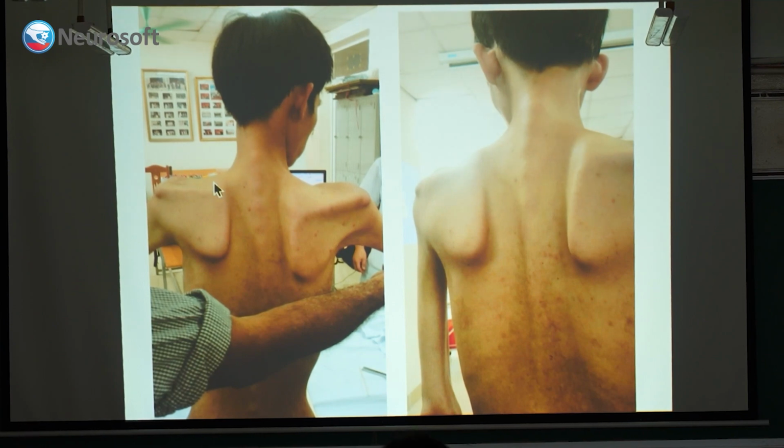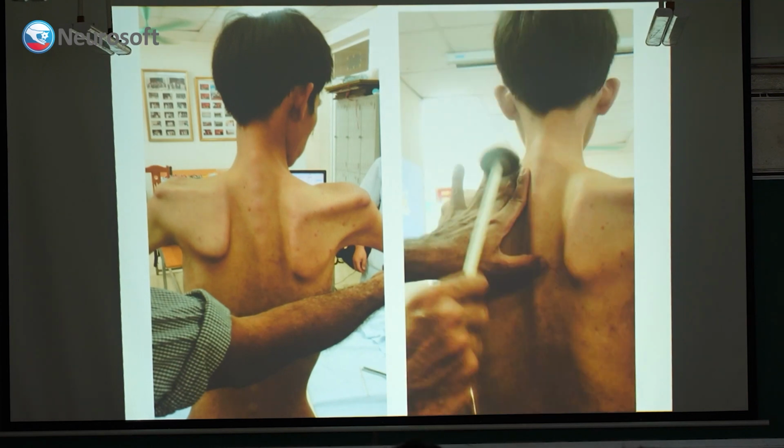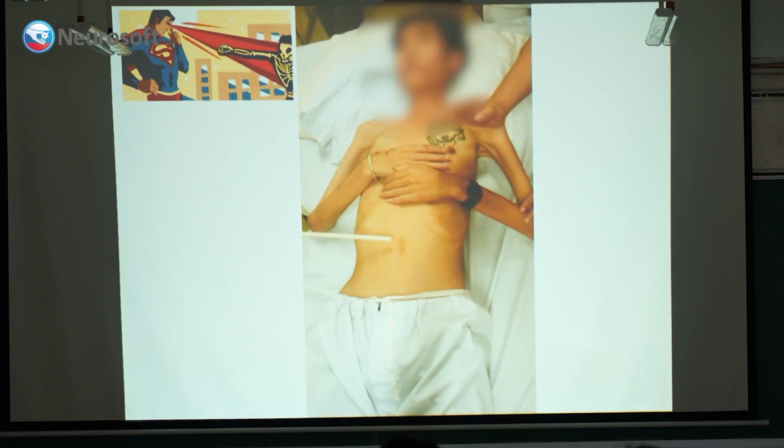And also you can see paraspinal muscles are atrophic. You can see the spine well, prominent. It means that paraspinal muscles are also atrophic, right? I think in this case, I would actually suspect the possibility of late onset Pompe disease. Of course, it's rare, but because it's a treatable condition, I think you should prioritize that. We have to find the patient. Yes, and also when he was lying down, it looks like he has some respiratory, I guess, problem.